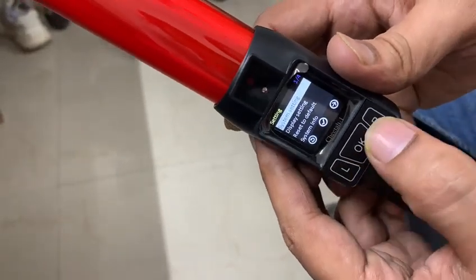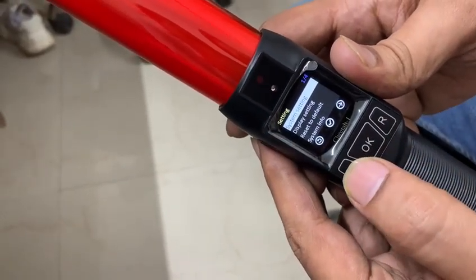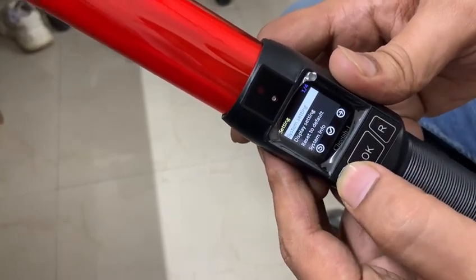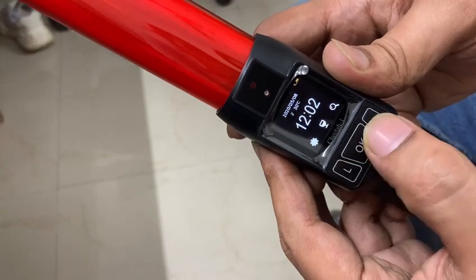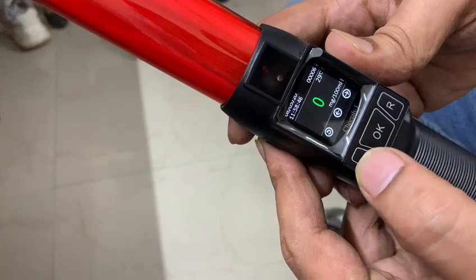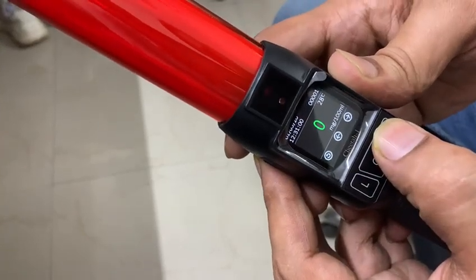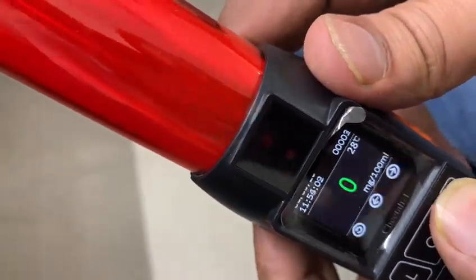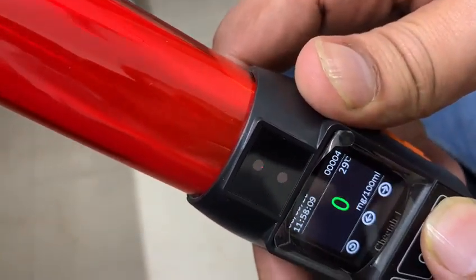These are the basic settings on this device. These are the previous readings of the alcohol tester — like you can see: 2, 3, 4, 5, 6.